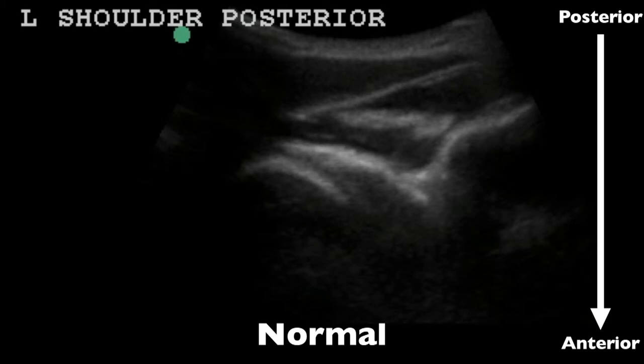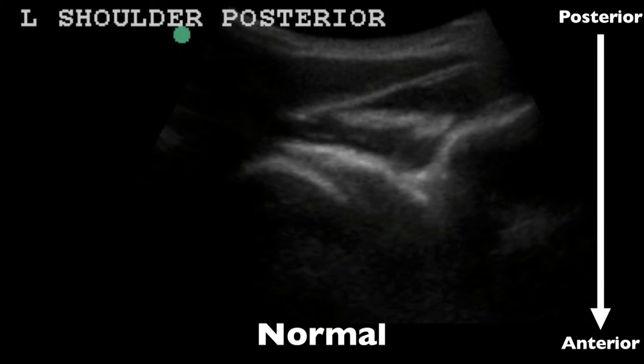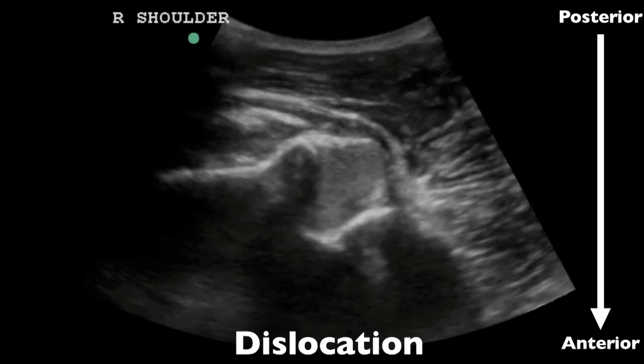What I'd recommend — because you may not do these frequently — is to look at their normal shoulder first. Always look at normal first so you'll know what their anatomy looks like. In this case, this was a patient with right shoulder pain. This is zoomed in a little bit, but we're going to see that this is our humeral head in blue and our scapula in red. Now we have those same two objects, and now looking at the right shoulder we can see our scapula is right here and our humeral head is way down here.